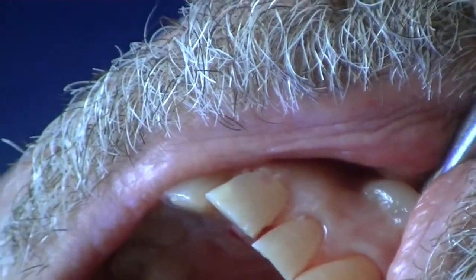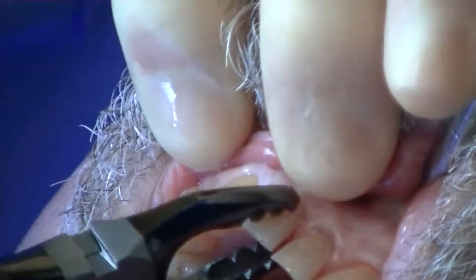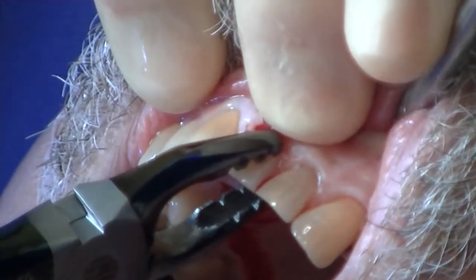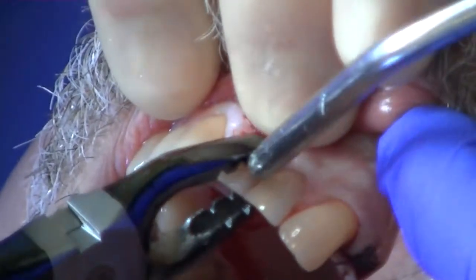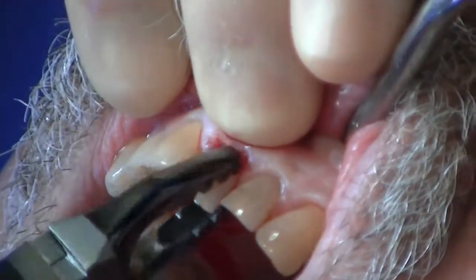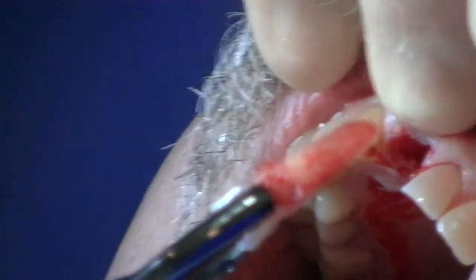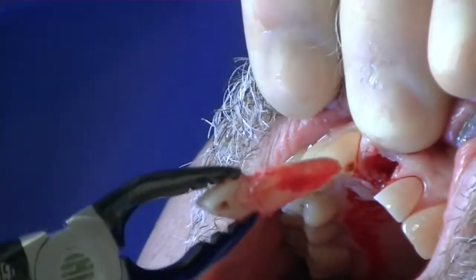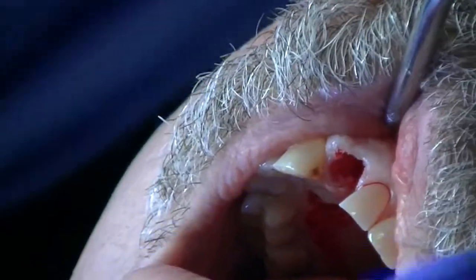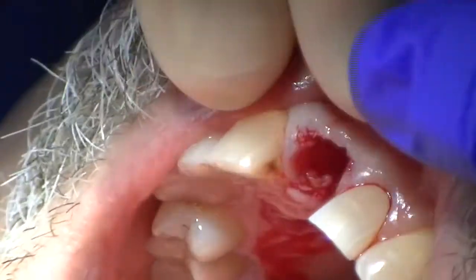And then we'll simply take a tooth delivery instrument of some sort. And let's see where we are. Again, this is resorption here. So I'm simply, very carefully, very slowly removing the tooth, without potentially damaging the facial plate of bone. We saw in the CT how thin that facial plate was.